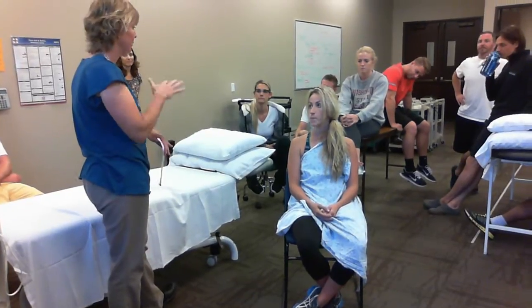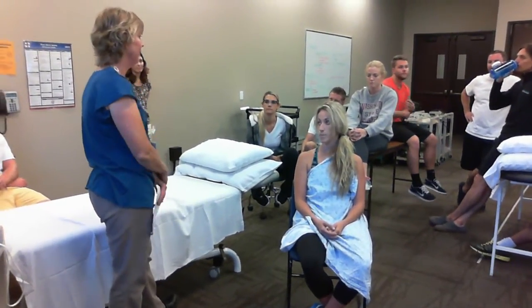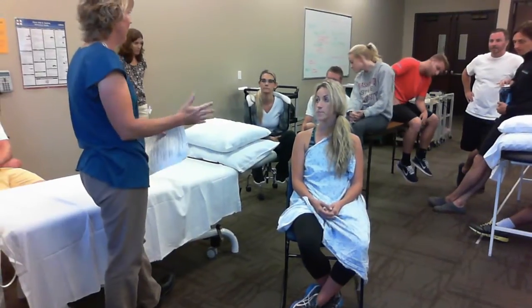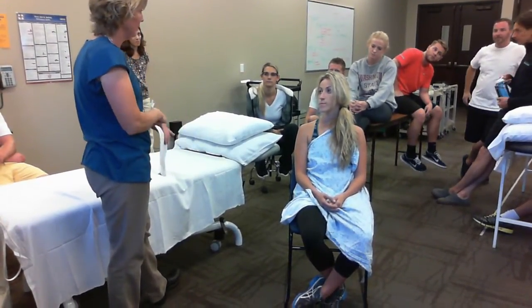And this is going to help reduce your pain that you're having and any spasming that you might be having in your muscles there. And that will help you to be able to sleep better and to get dressed a little bit easier and especially perform the exercises that I want to do with you. Does it sound like a treatment that you'd like to try?